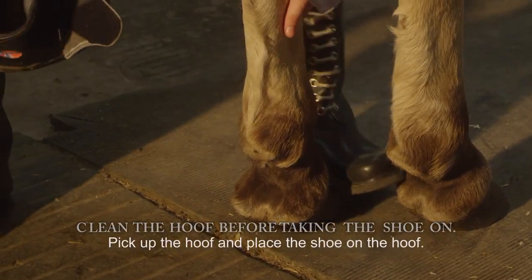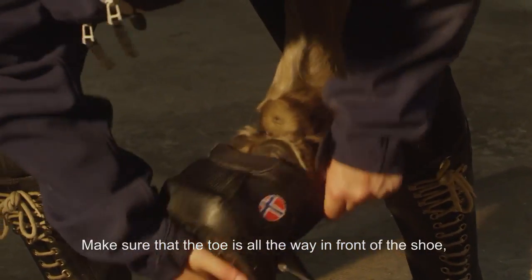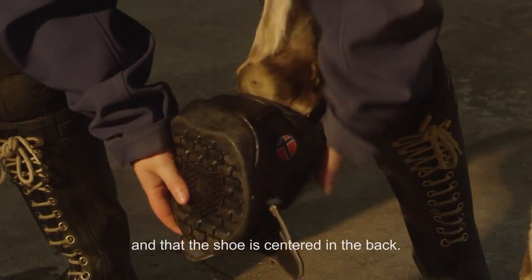Pick up the hoof and place the shoe on the hoof. Make sure that the toe is all the way in front of the shoe and that the shoe is centered in the back.